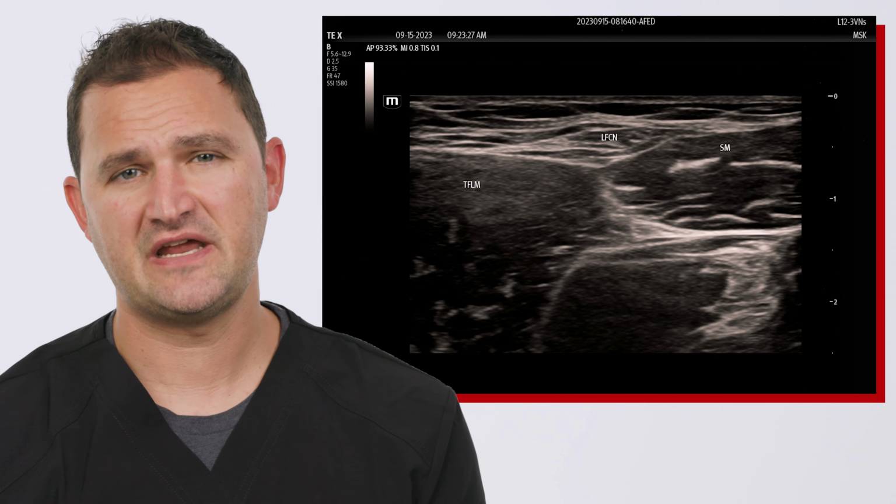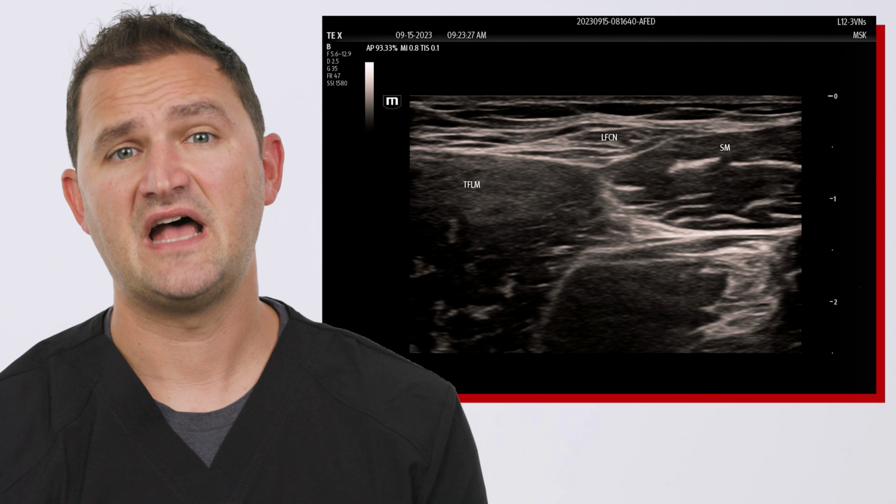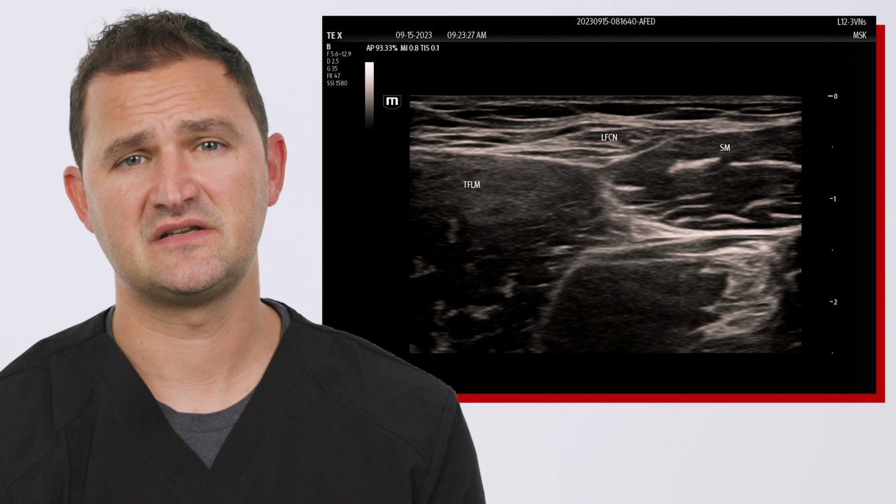The lateral femorocutaneous nerve runs over the sartorius muscle caudally and then over the tensor fasciae lata muscle as it moves more caudally on the lateral aspect of the leg. To block the lateral femorocutaneous nerve, 2 to 5 cc's of local anesthetic is all that is needed to block this nerve. Any local anesthetic of your choice can be utilized, whether it's ropivacaine, bupivacaine, or even liposomal bupivacaine to numb this nerve as it goes laterally over the lateral aspect of the hip. This is a great addition to your block armamentarium to get lateral hip pain associated with lateral incisions from, for example, lateral hip arthroplasties.